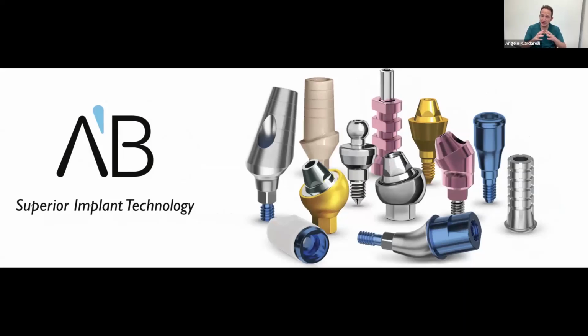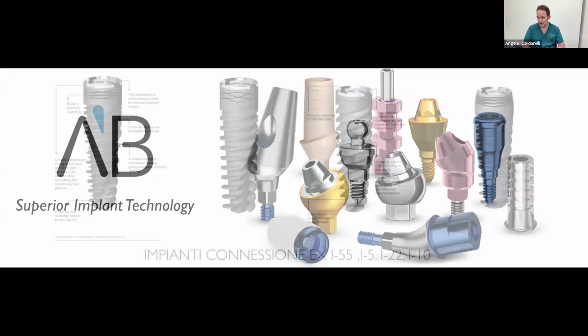The very new interesting thing about the ION is the possibility, if we are using the multi-unit abutment, to use this new multi-unit abutment shape with the switching platform. With this shape, we can manage the soft tissue better. And I will show how we can use this kind of multi-unit abutment in full arch rehabilitation.